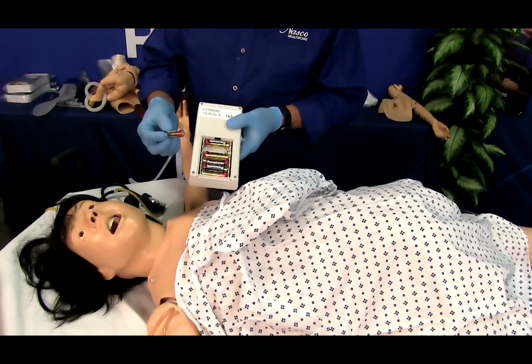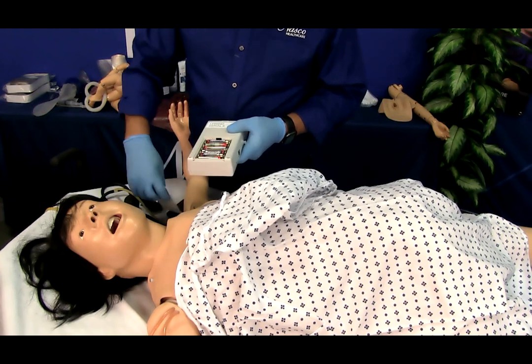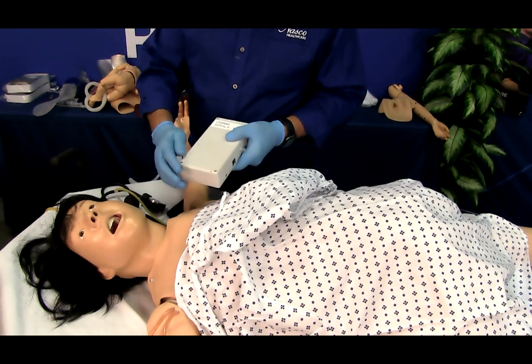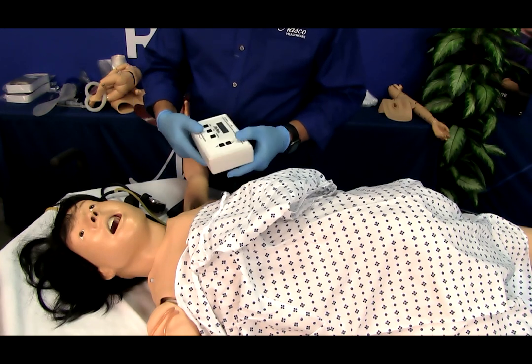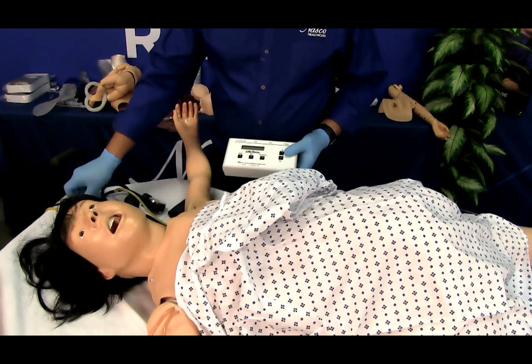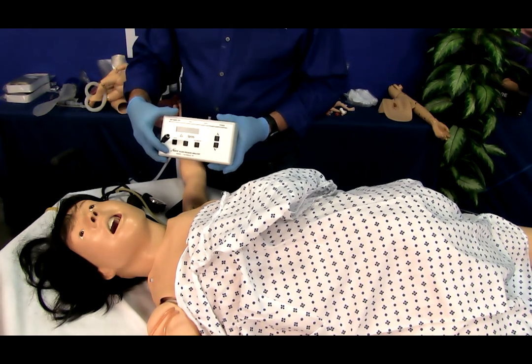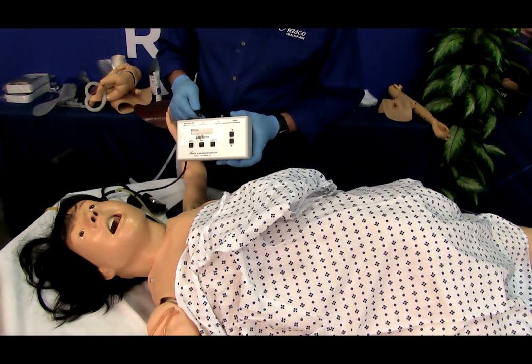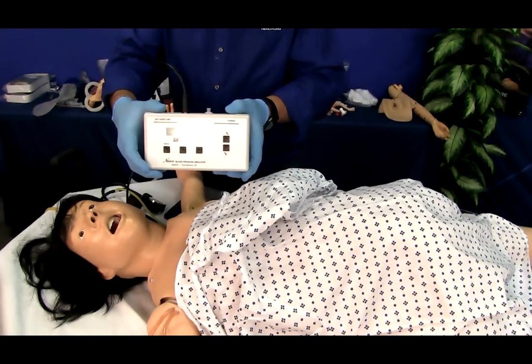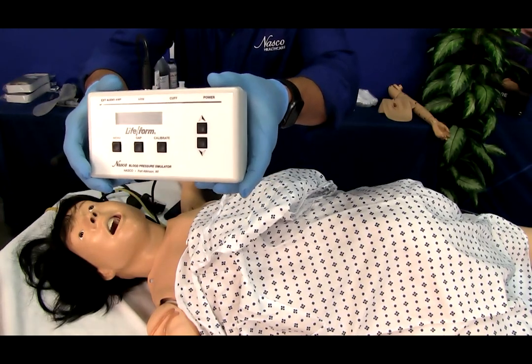Install 6 AA batteries as indicated by the orientation diagram embossed in the bottom of the bracket. After the batteries have been properly installed, reassemble the electronic control unit by sliding the compartment closed. Turn on the electronic control unit by pressing the power button on the top right of the unit. Observe the display and verify that a readable display is present.